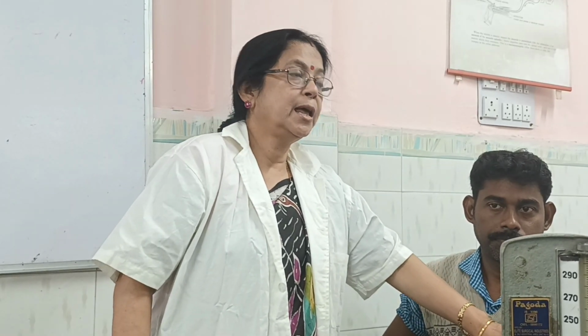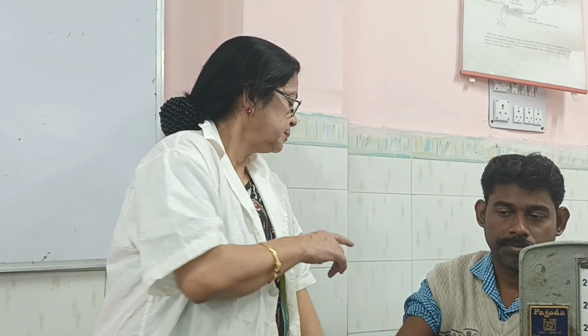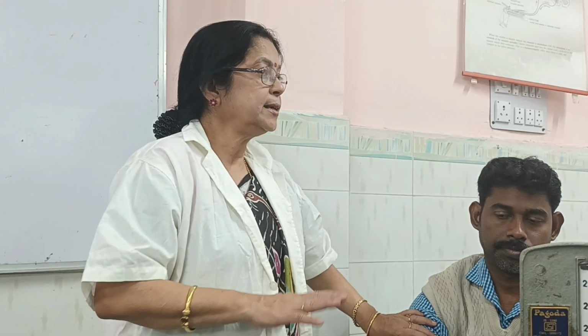So it is better to measure in the left brachial artery. But you have to measure the blood pressure standing on the right hand side of the subject, whether you measure from the left arm or right arm. Any arm you can measure, but you have to do it standing on the right hand side of the subject, with proper illumination and proper exposure of the subject. Now I will show how to tie the cuff. First, deflate it properly.